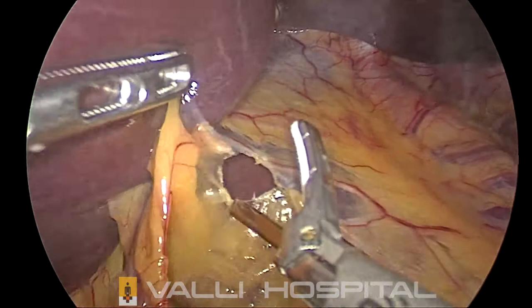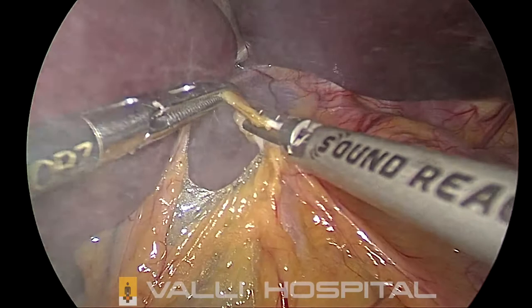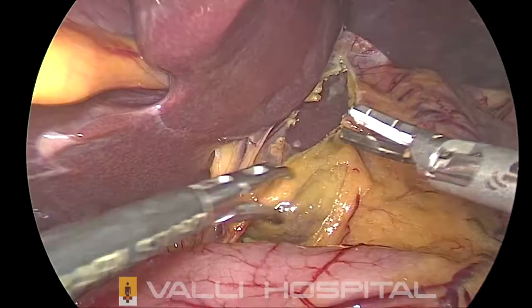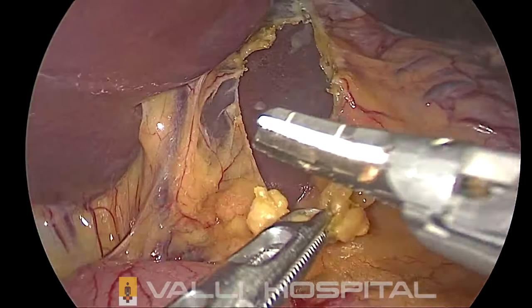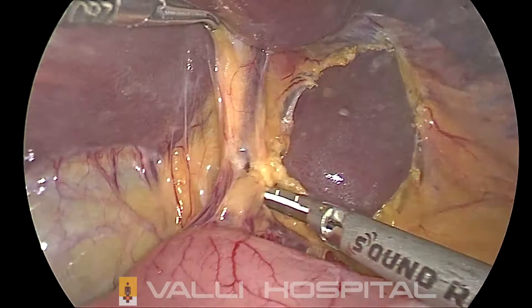This is the pars flaccida. We are dividing the pars flaccida. Sometimes you get the accessory left hepatic artery. If it is there, it has to be preserved. You can see here also you get the accessory left hepatic artery, but it is lower down, so we need not worry about it. When it is bigger, you need to preserve them. You have to work above and below the artery. It is well lower down, so we need not worry about it.